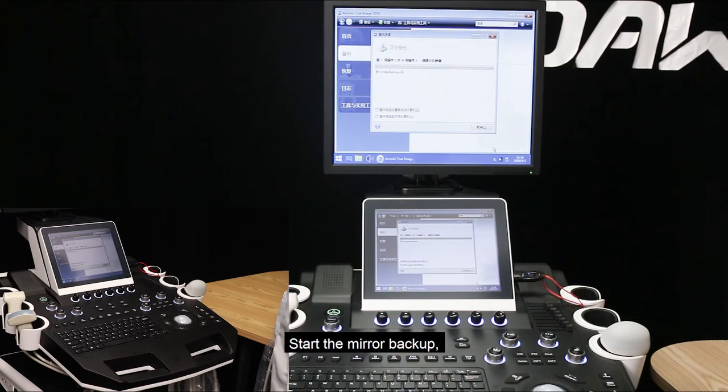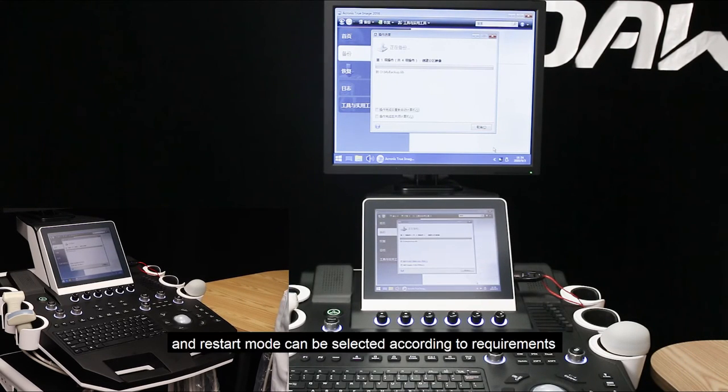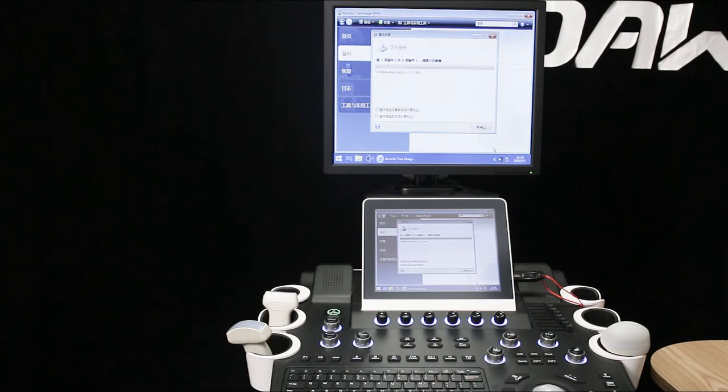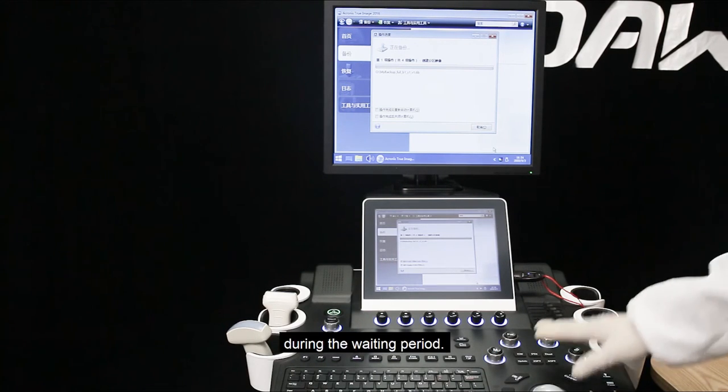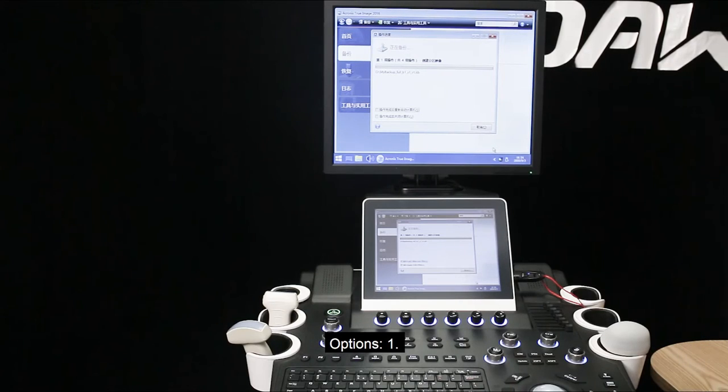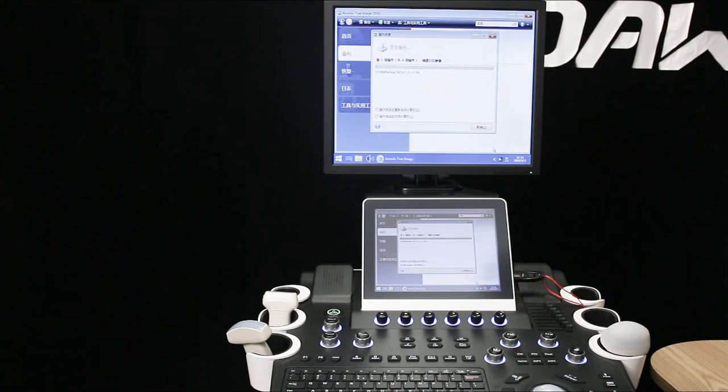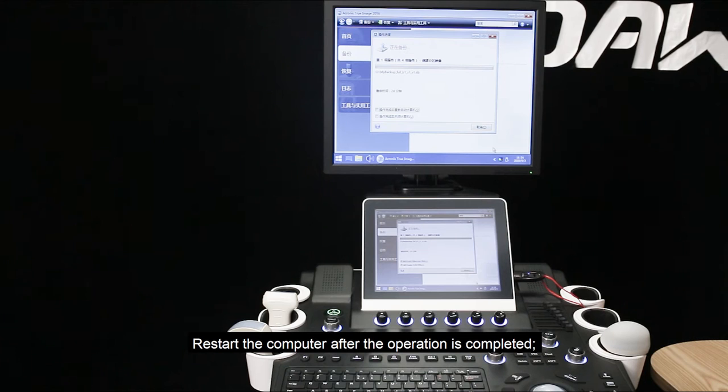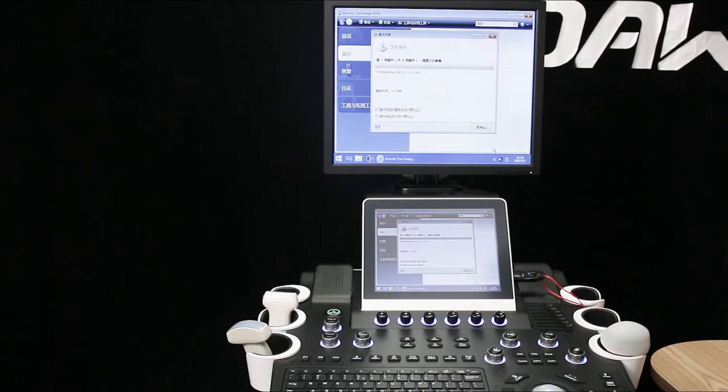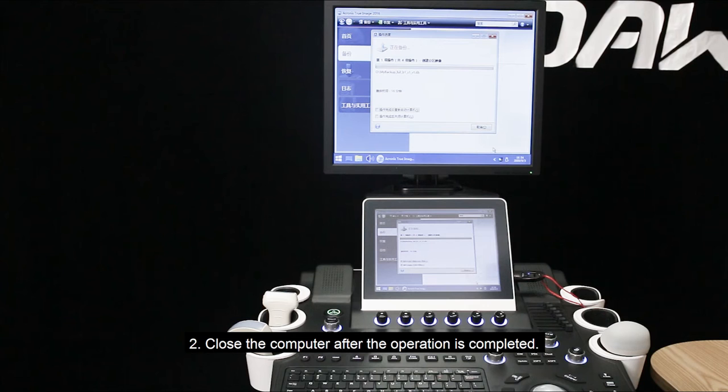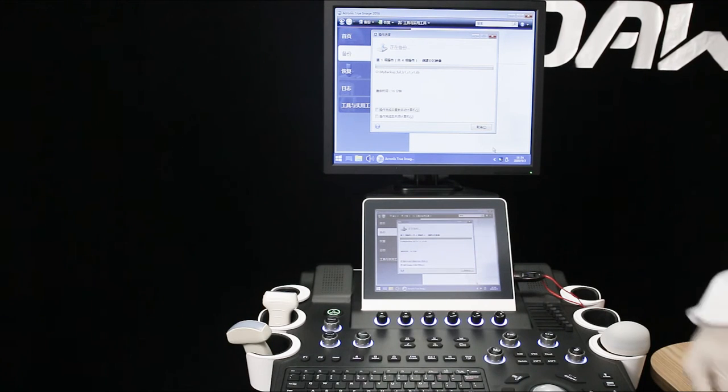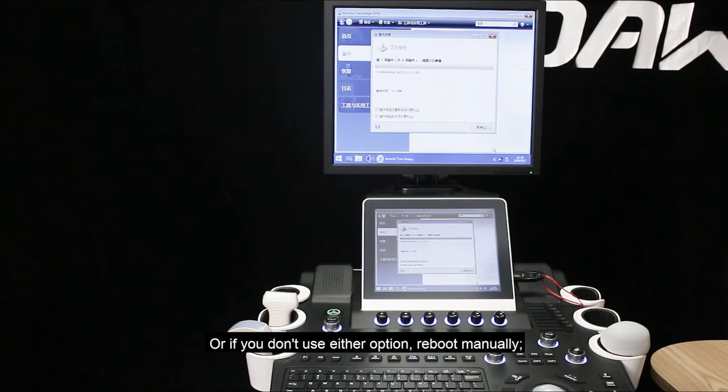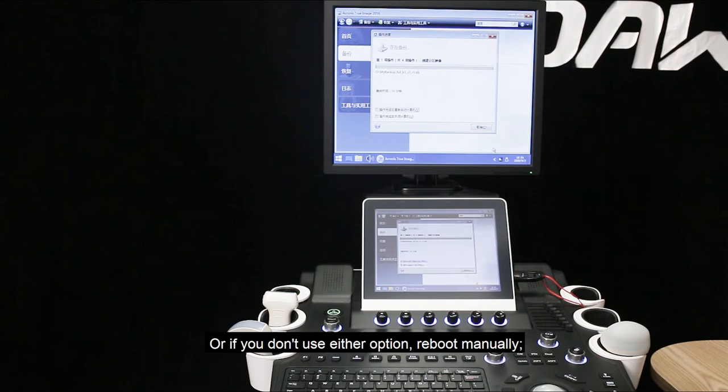Start the mirror backup and restart mode can be selected according to the requirements during the waiting period. Options: 1. Restart the computer after the operation is completed. 2. Close the computer after the operation is completed. Or if you don't use other options, reboot manually.